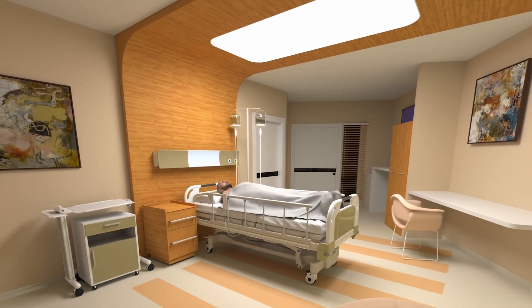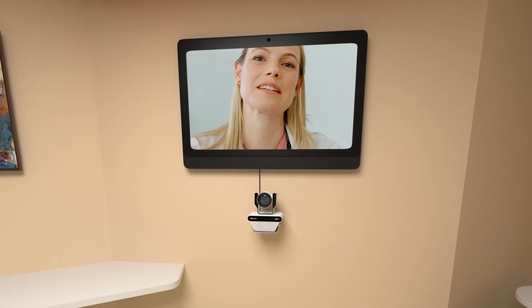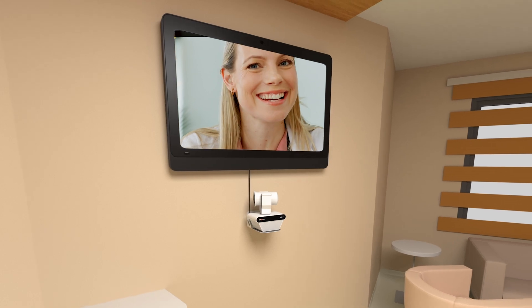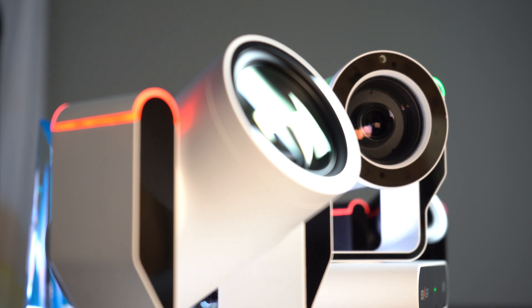Patient privacy is paramount, and as such, the Nutrix comes equipped with features to allow the patient to know when the camera is active, with addressable tally lights and the ability for the camera to turn itself away from the patient when out of use. This is just one extra added layer of patient privacy.